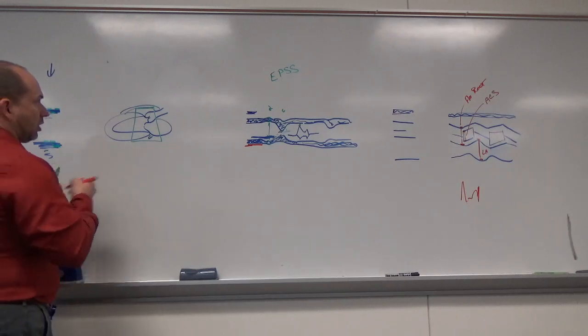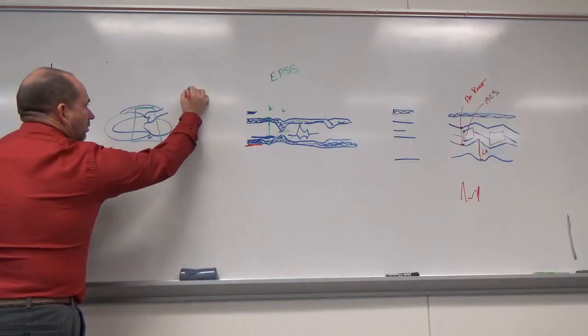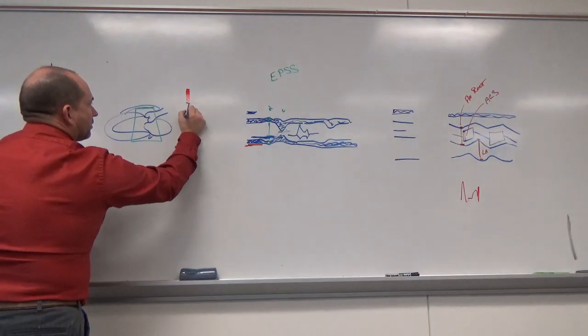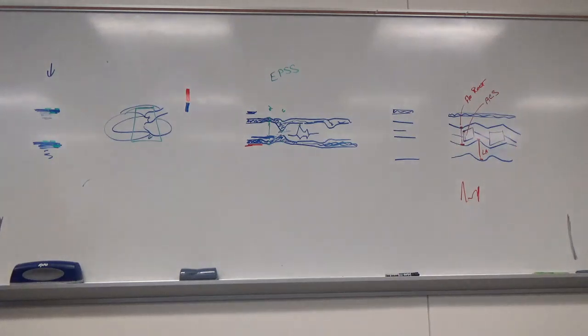We use the BART protocol, so blue away, red towards. So here's my color bar indicator on this side, just for the sake of completeness. Our scale on this is usually like mid-60s to about mid-80s-ish.